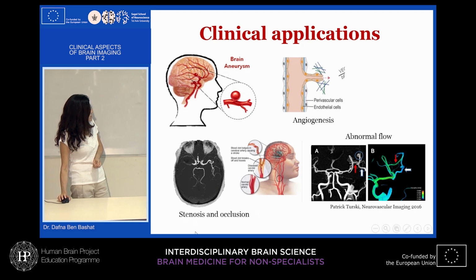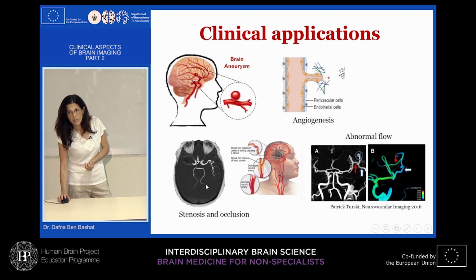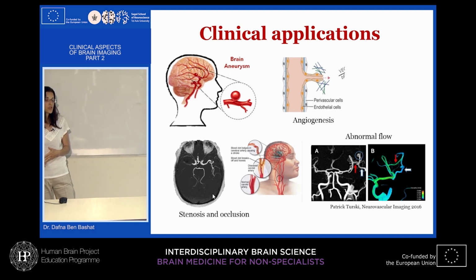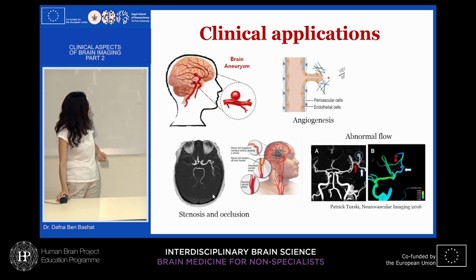Of course, if we have any stenosis, any occlusion of blood vessels, we want to know the location. If it's a stroke, if it's in an acute phase, if we want to do an intervention, of course, we need to know where we need this intervention.